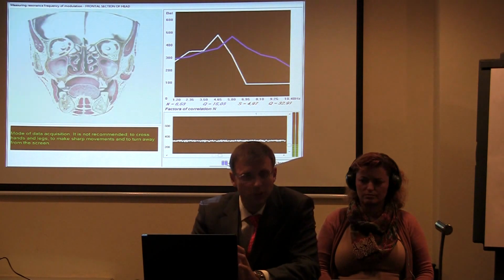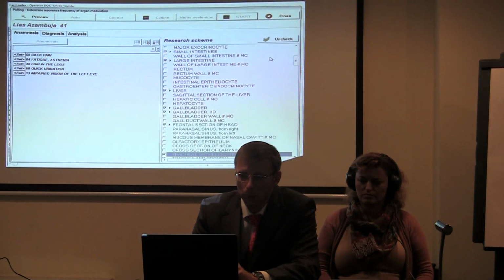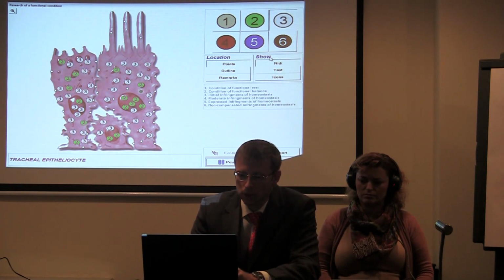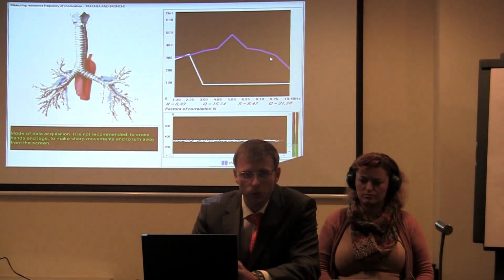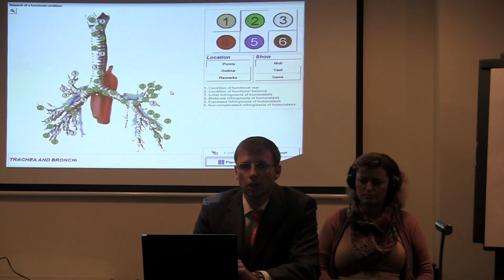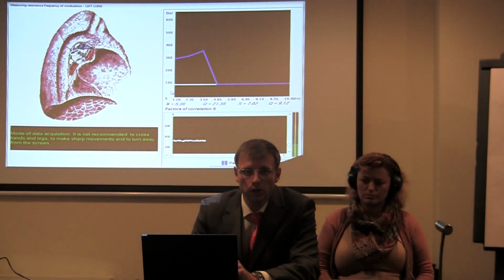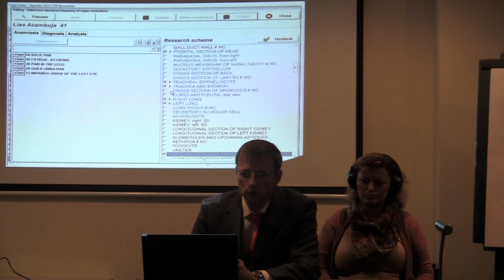For scientists there is a special description of these points, but for the patient it's better to describe that 2 is okay, 6 is bad. If you have 6, you have some pathology or serious disbalance and treatment is necessary. But sometimes some patients have a lot of 6 marks, maybe on one body part or all over the body, and after the analysis of these organs, we see no real pathology. It means he has some energetic disbalance, but not pathology yet. It's very good that he came at this moment, and it's necessary to find some treatment to correct this condition before some pathology appeared.